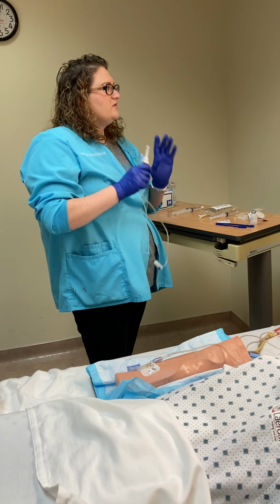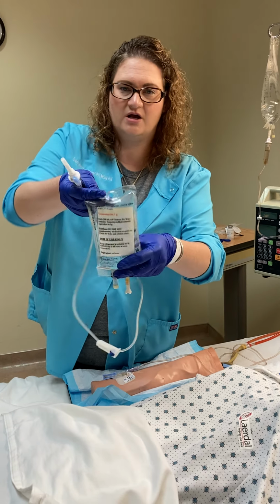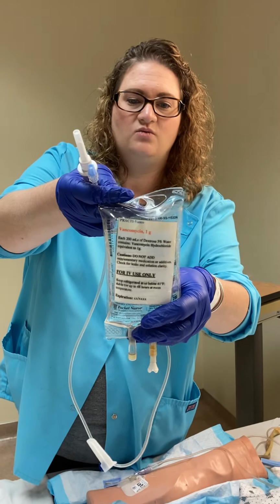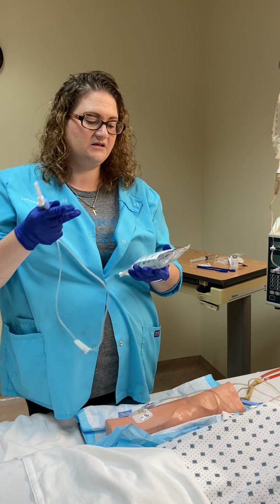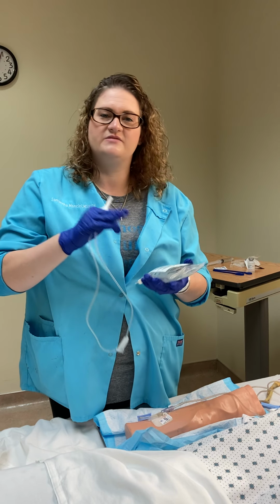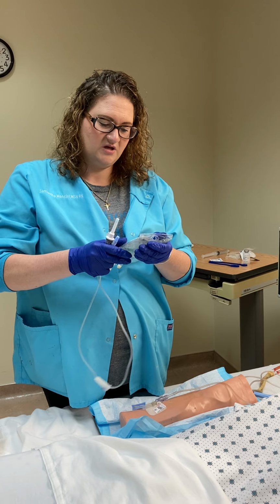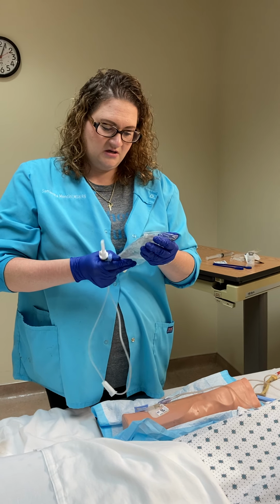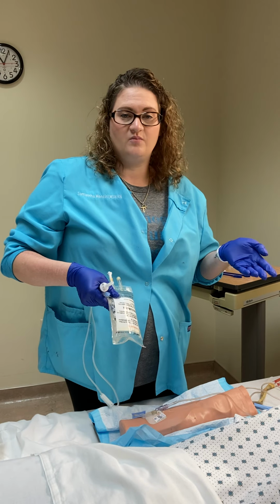So we will say that we have an order for vancomycin for Mr. Walking Feather here. Again, we're looking at the same thing. We want to look for clarity, expiration date, any signs that there's ill integrity, rips, tears, leaks, anything like that. We wouldn't want to administer this. We want to know the rate at which to infuse it, so we can look that up in our books.